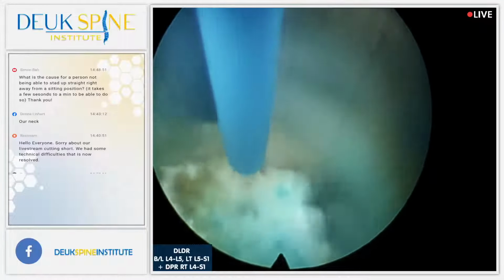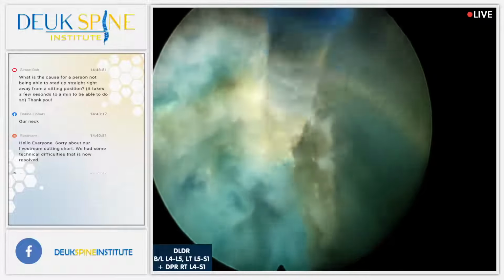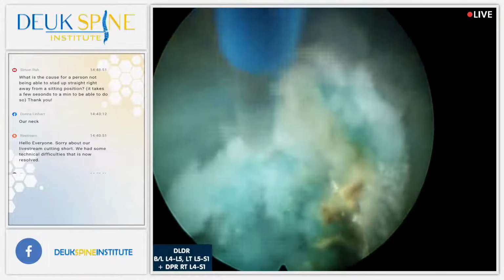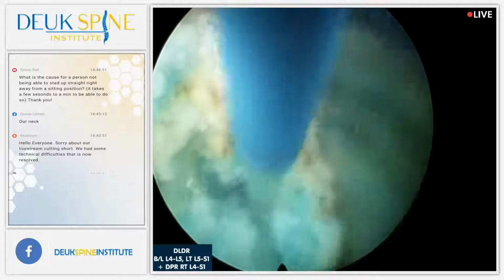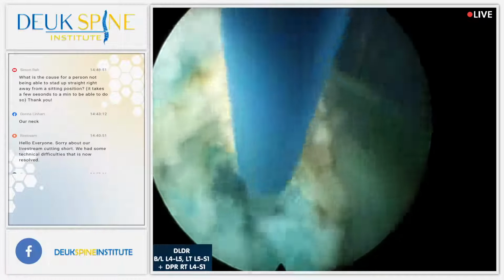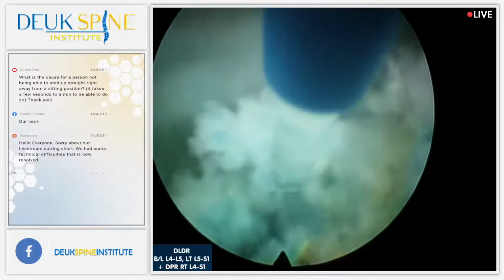Yeah, because right now this stuff doesn't hurt deep. It's only when I get to the surface that it really starts to hurt, because that's where most of the pain fibers are, the surface of the disc. So you can put them lighter when I'm deeper. When I'm deeper, you're lighter. When I'm lighter, superficial, you're deeper. Does that make sense? Or is that too much of a word soup?